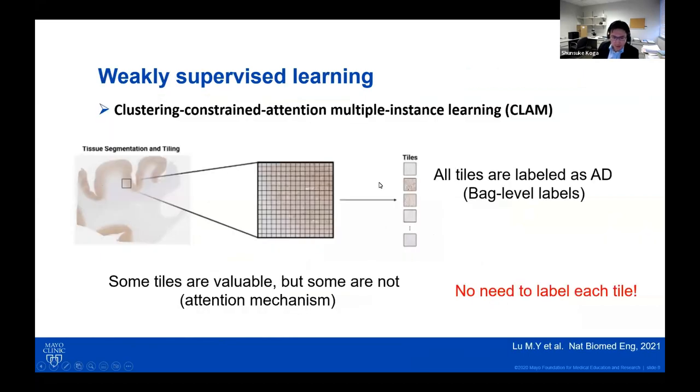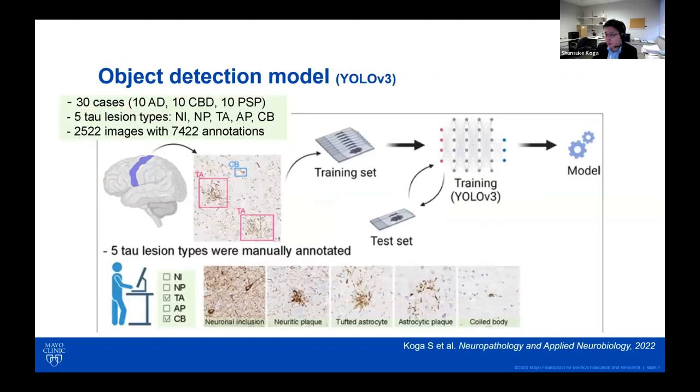So our previous models worked pretty accurately. It's very good. But both models were based on supervised learning, so human pathologists need to prepare labeled datasets. As I mentioned, labeling datasets is a very painful and tedious task. Actually, collecting labeled datasets of medical images is a bottleneck in developing machine learning models in the medical field. For example, for the previous model, to collect the dataset, I reviewed and annotated more than 2,500 images. It's a very, very painful task.